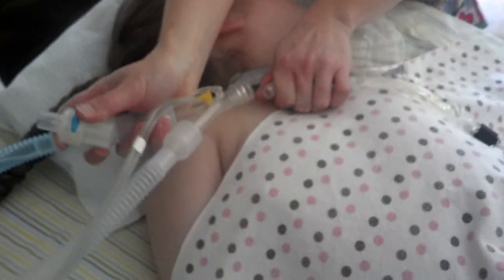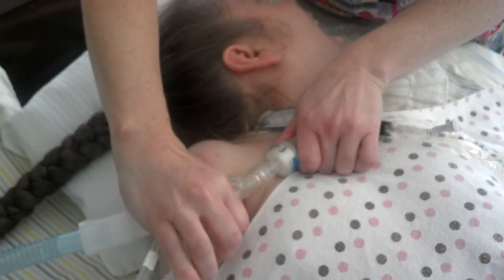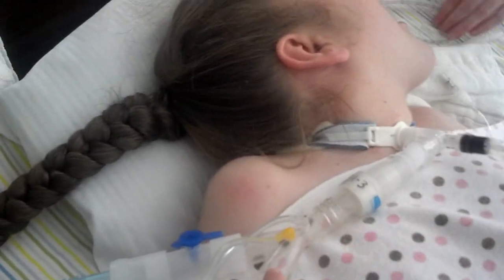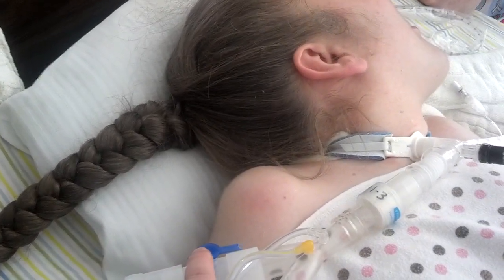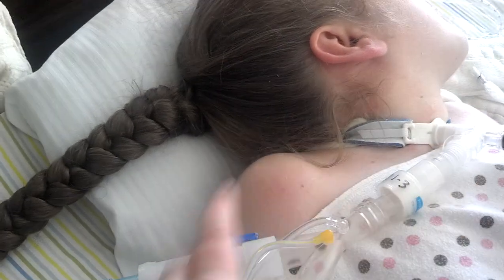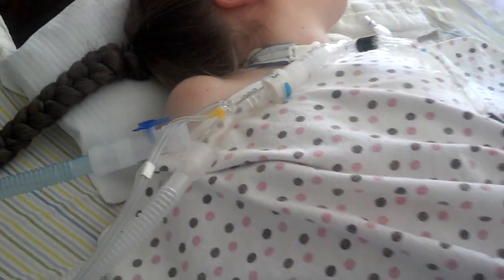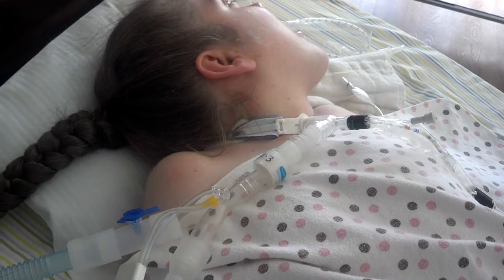Now we put the HME on. The research says that the closer you get the HME to the patient, the more effective it is, so we put it in front of the Y joint, but a lot of people put it back here. Putting it in front of the Y joint means your MDI adapter is back here. So when you need to give breathing treatments, you have to remove the HME, give the breathing treatment, reconnect, and then when you're done, put the HME back on — which isn't ideal to interrupt the circuit, but we only have to do one breathing treatment so it's not a huge deal.